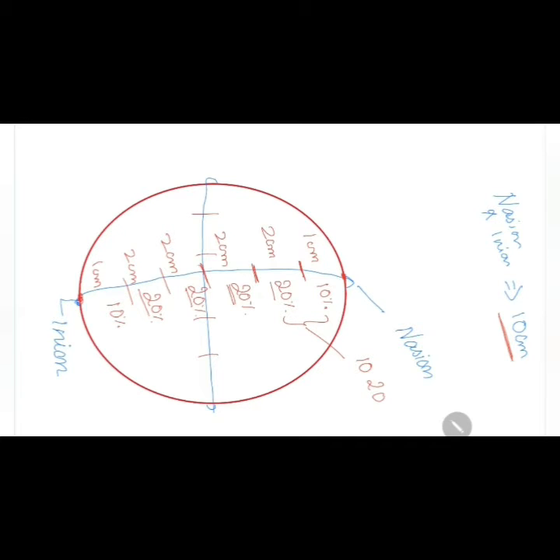Now we should know what names should be given to these electrodes. We know that electrodes are going to be placed at these particular positions because of the nature of the 10-20 system. We should know the name that should be given to each electrode. So to do that, let's go to the next diagram. Here I will show you how the brain has been classified for the ease of naming electrodes.